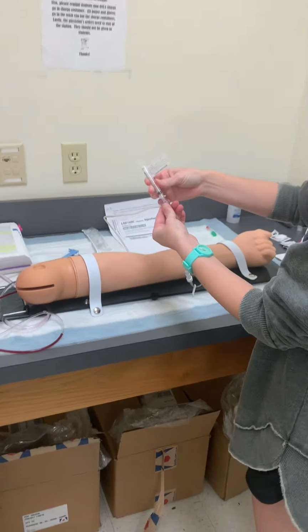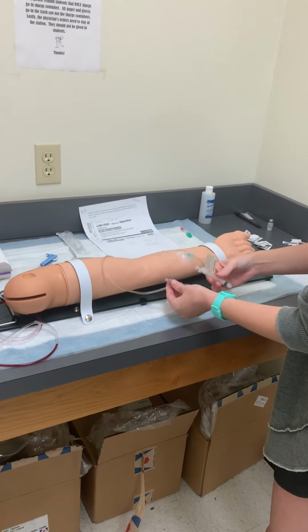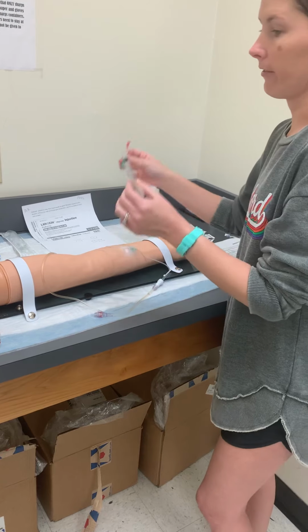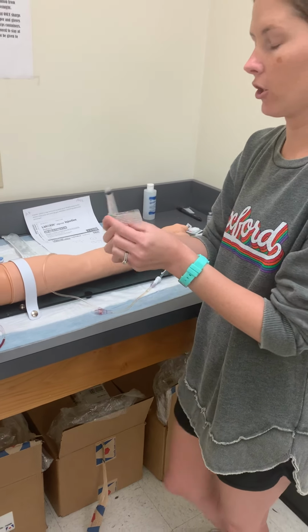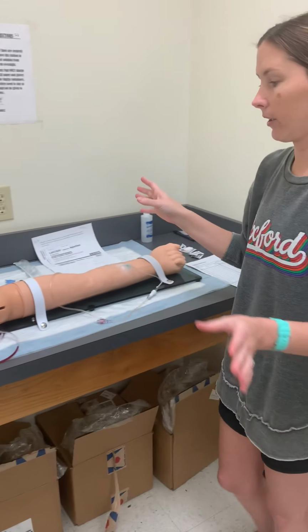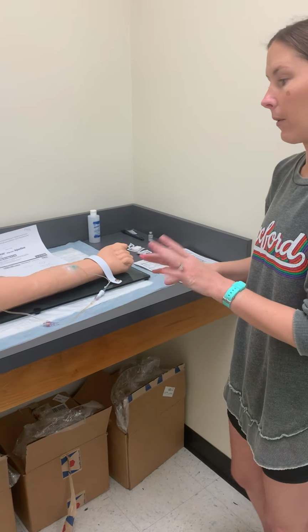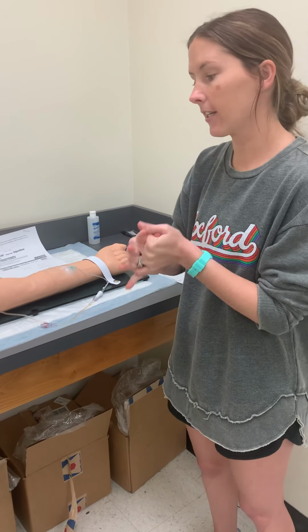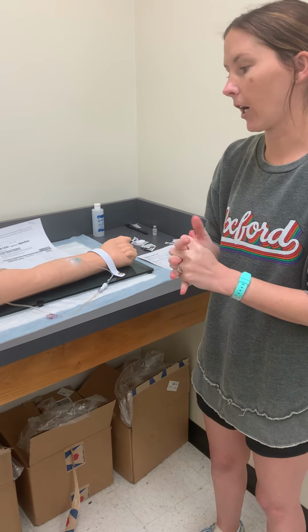Okay, when it's finished, I will take off my syringe. I'm still monitoring my patient. I will discard of my syringe and my needle in the sharps container. And then I will monitor my patient. I will monitor their labs, especially for any signs of digoxin toxicity. And then I will also document in the MAR.